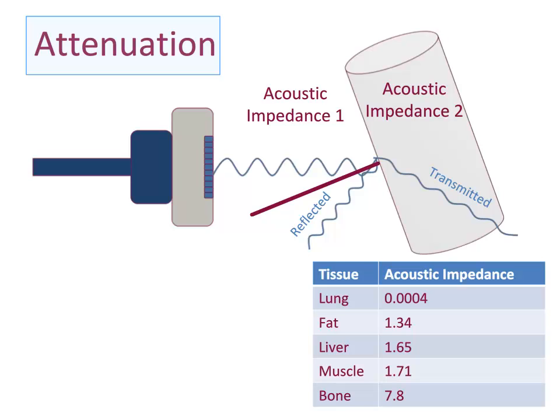Attenuation is the term used to account for the loss of wave amplitude as it travels through a medium, due to all mechanisms which include reflection, absorption, scattering, loss of heat. Ultrasound, originally used in World War II to figure out the depth of submarines below sea level, is applied to medicine in the same way.